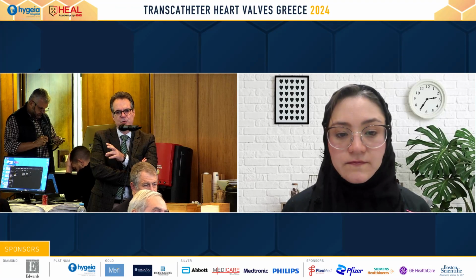Hello, it's Dimitris Nikas from Ioannina, Greece. Just a short practical question. Sometimes we find difficulty to see if tricuspid regurgitation caused by a pacemaker or defibrillator lead is due to the lead itself, or if it's caused by adhesion or puncture of the tricuspid leaflet. Do you think that CT could help us more than echocardiography to find out what the main reason is? I would like to have the opinion of the panel. This is really difficult for us sometimes to differentiate which is the main cause.